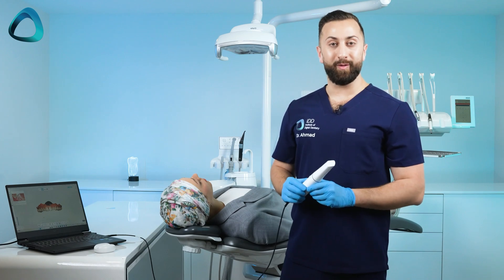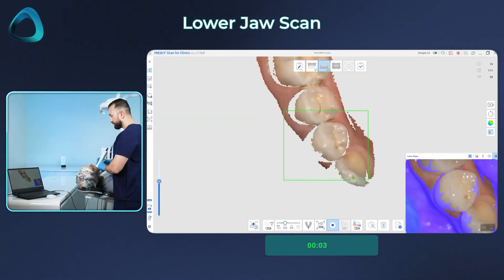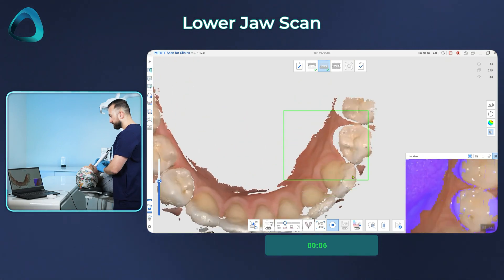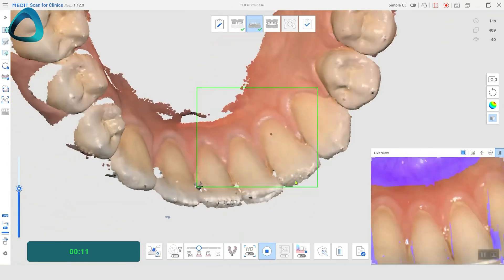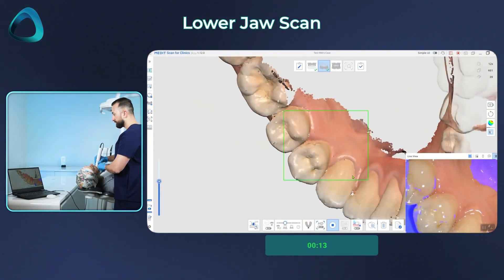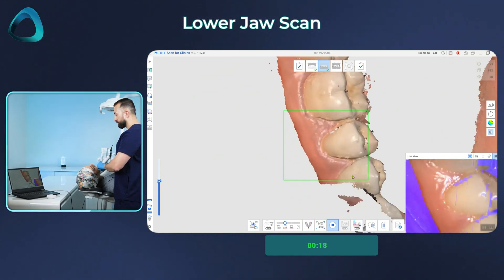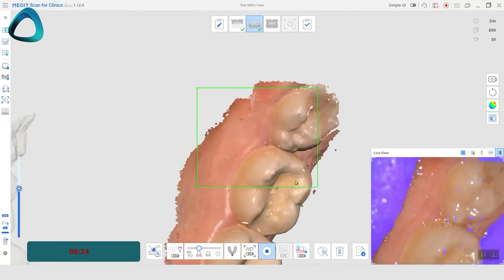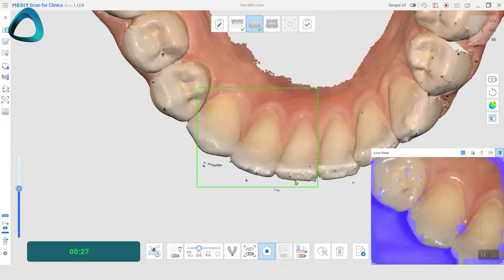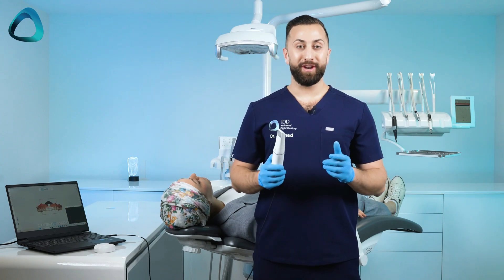So now let's scan the lower jaw. We move down to the lower arch — we always start on the occlusal aspect of the terminal molars, moving across the occlusal aspect and making sure to capture the incisal edges well when moving across the anterior teeth. We rotate to the lingual, move across back to where we started, and one final rotation buccal to complete our scan. Good soft tissue retraction is critical in any scanning process. Finally, we go to the opposing side and complete the scan, filling in any areas such as embrasure areas. That is the lower jaw scan completed in 30 seconds.